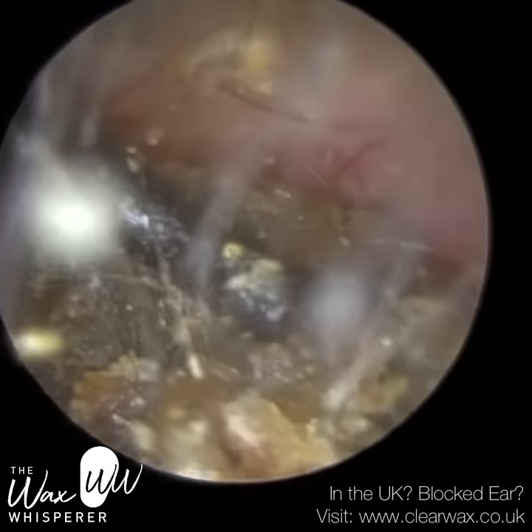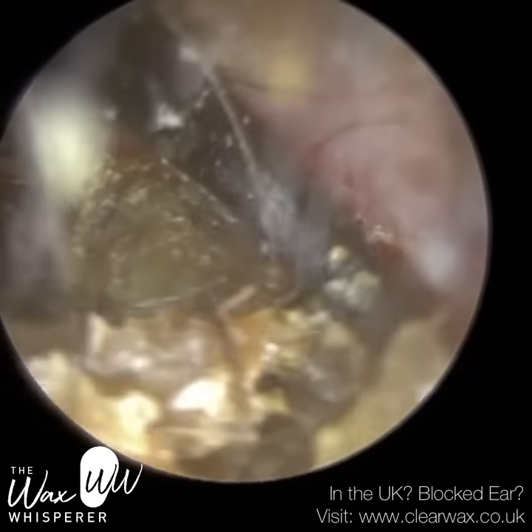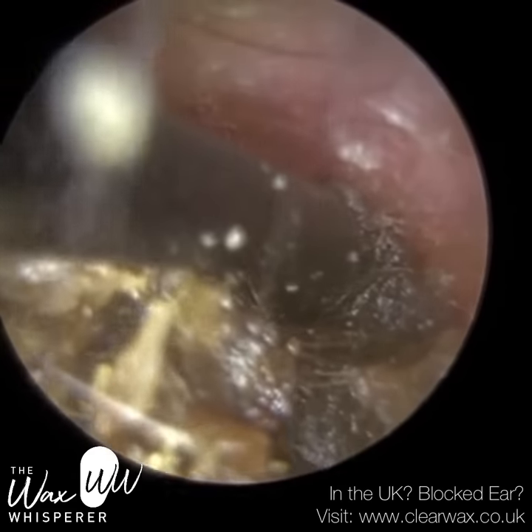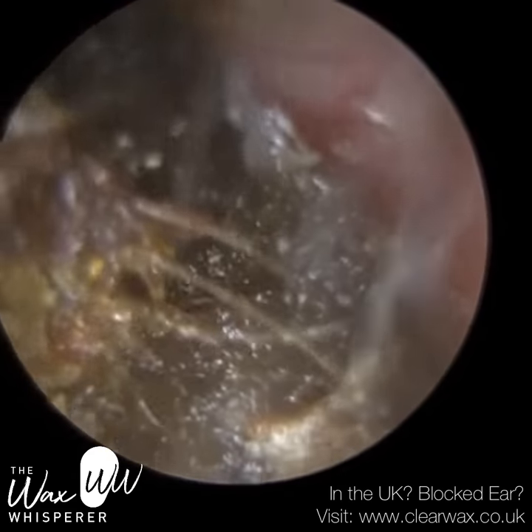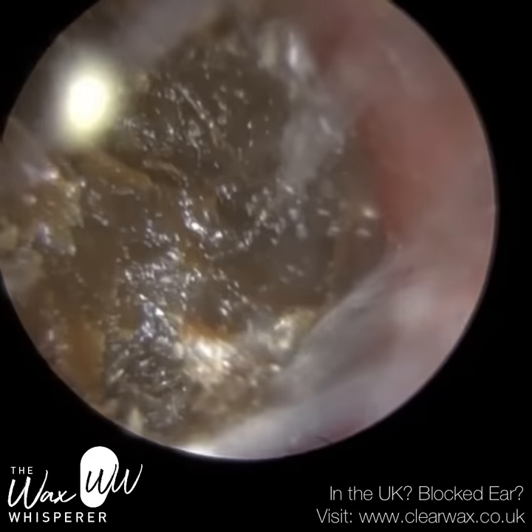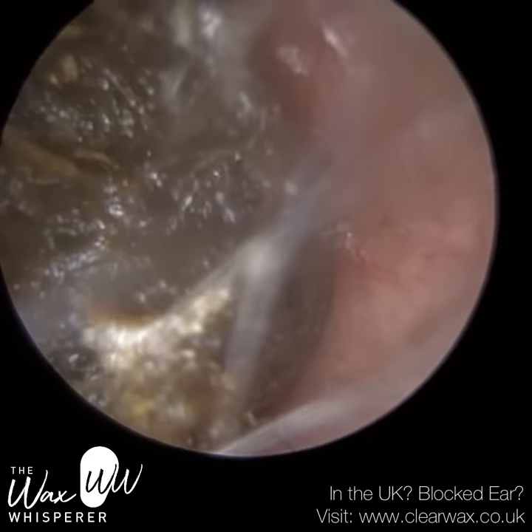I'm going to the back part of the ear canal, trying to separate the wax block away. I've rotated the hook almost more than 180 degrees there. But as I got into the body of the wax, the hook just sliced through it like a hot knife through butter.